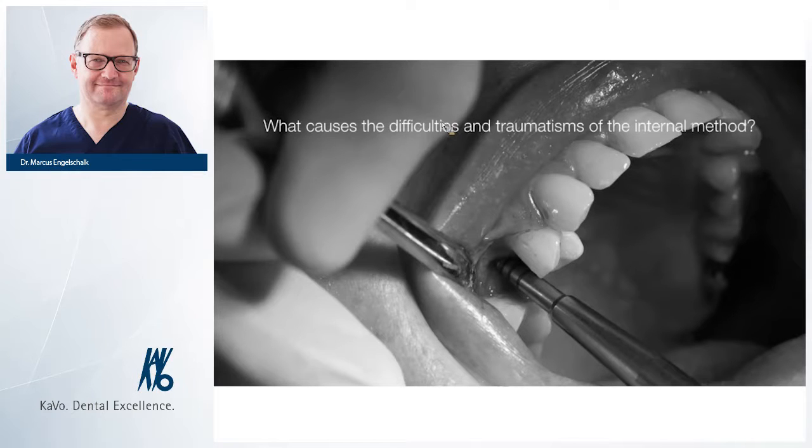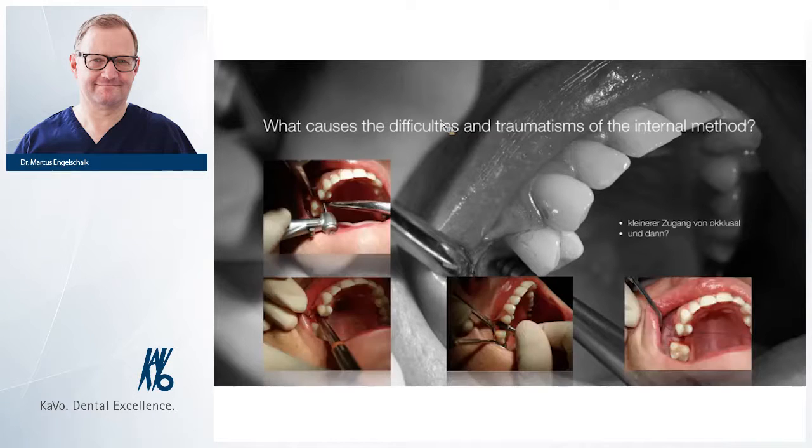Well, it's clear that the safe entry is not a real safe entry because you have a huge area where you want to have a lift from the sinus membrane, because you have to create your window. Significant elevation, for sure, you will have, because you can lift the membrane and you can augment as big as you want.